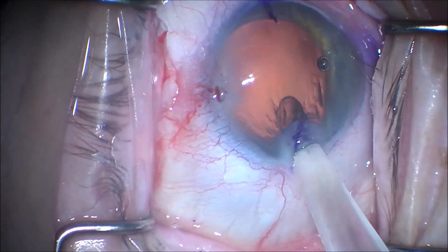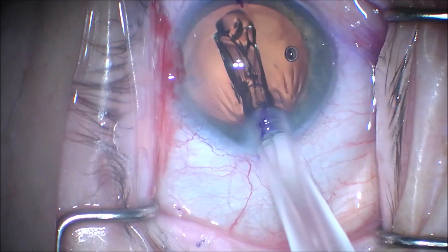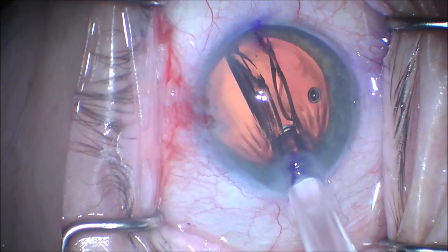We use a true mechanism injector, and you can see the lens is delivered in a very controlled fashion into the capsular bag.